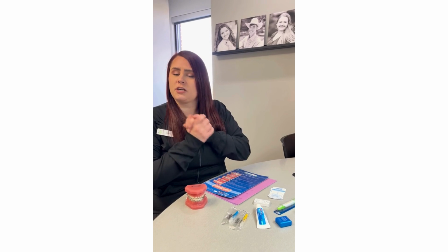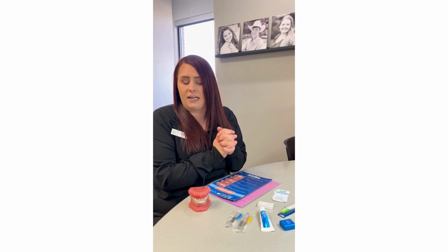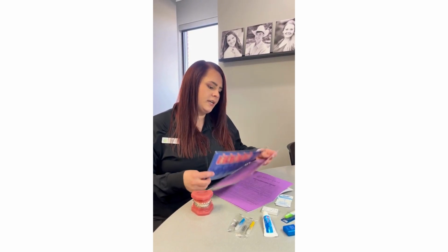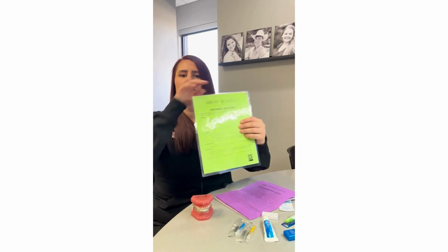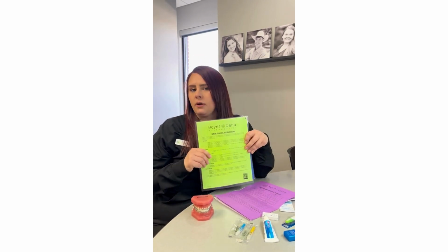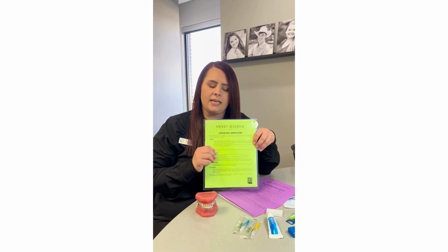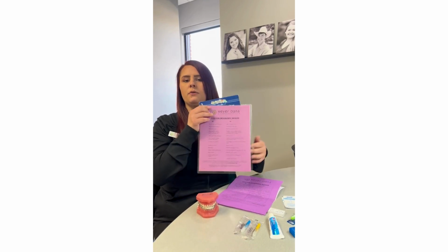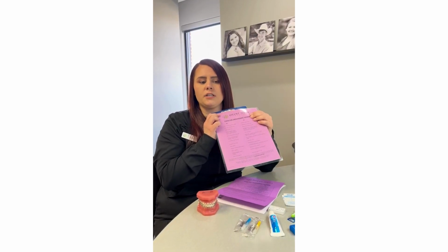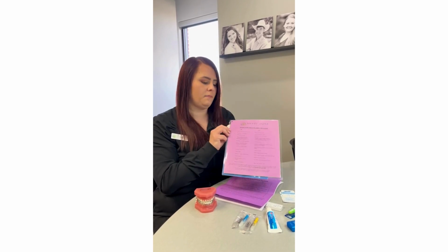So we stress brushing while you're in treatment because we want your smile to be absolutely beautiful when you get done. And we want to make sure that we give you the tools for success. We are going to send you with a sheet that will go over all your orthodontic instructions. What we really want you doing is brushing 3 times a day for 2 minutes each time. We want you flossing every single day as well. And then we also have a food list for you that we will go over to show you do's and don'ts of eating while you're in braces, as well as different alternatives for those.